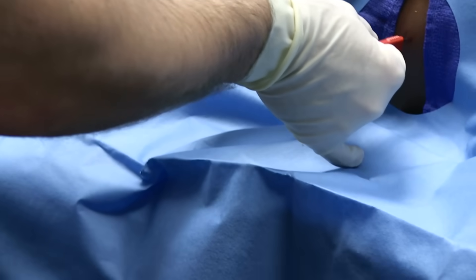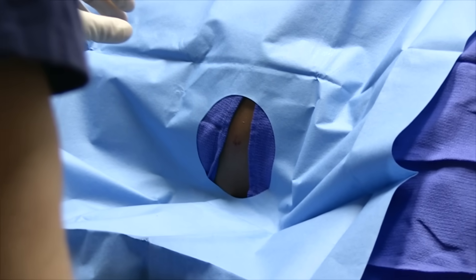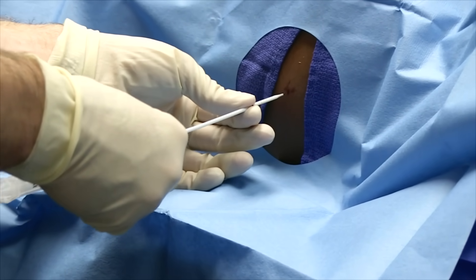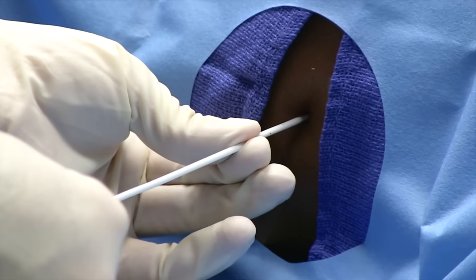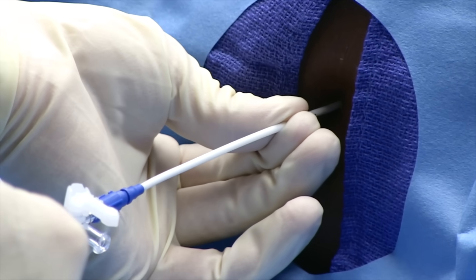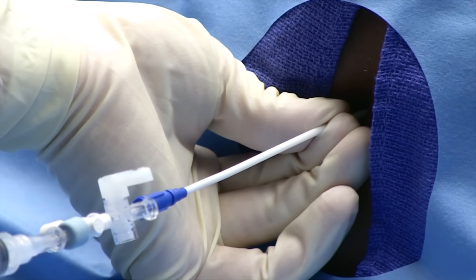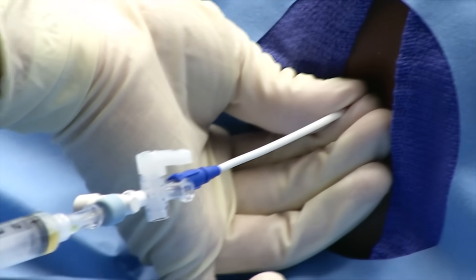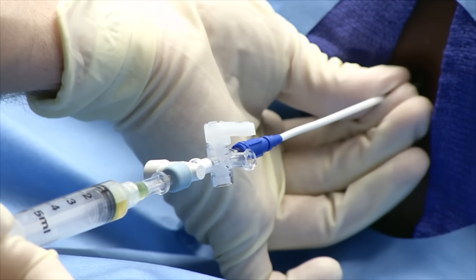Perfect. Now advance the needle — make sure you're parallel to the ground, because that's the way we did the ultrasound and that's where we found the pocket. Go ahead and advance the whole apparatus. Do you get a pop? Advance it just a touch more, now aspirate. Nothing — keep going. You may need to pull back a little on the needle. There's fluid now — advance it another half centimeter or a little bit more, because you can't offload it just yet. Keep advancing.